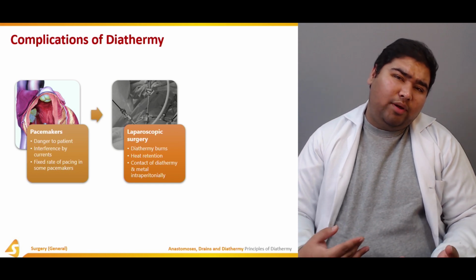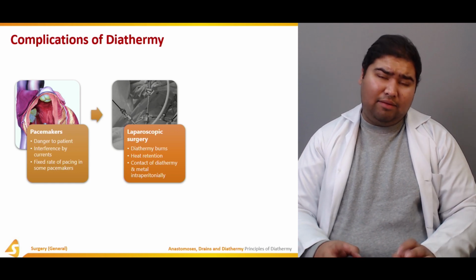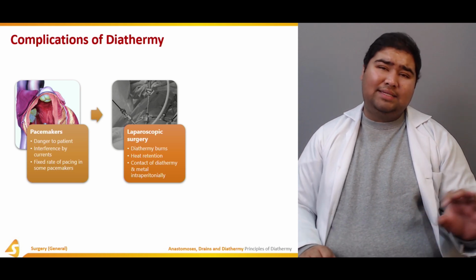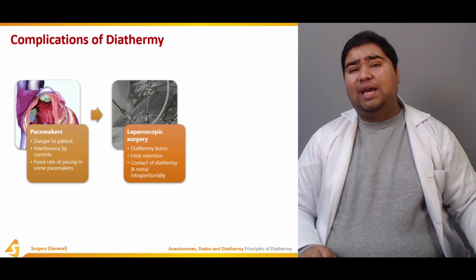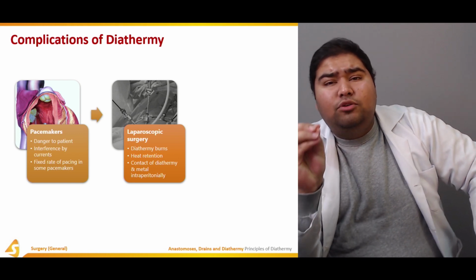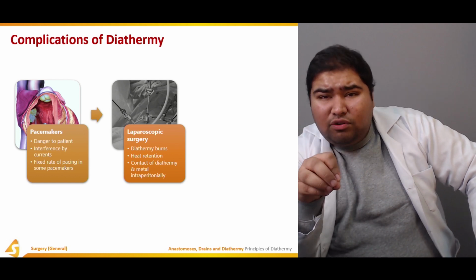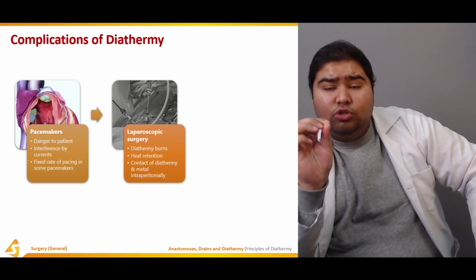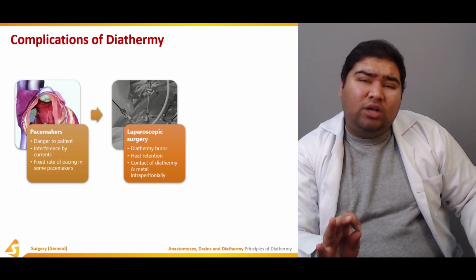Say you have your diathermy probe within the human body, not within your surgical field, however within the body, and somehow that gets pressed. Now this probe can damage whatever area it is touching. So you should be very careful that during your laparoscopic procedure, any instrument that is not being used must be retracted out of the body. If it is there, you should know where it is. It should always be within your surgical field and you should have a clear idea of what is going on.